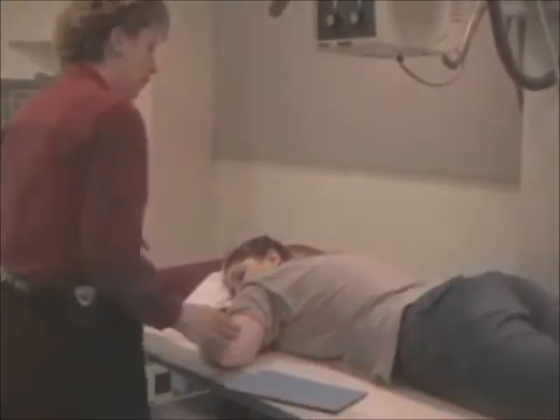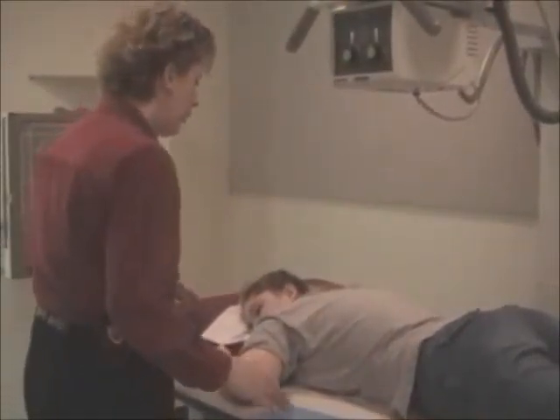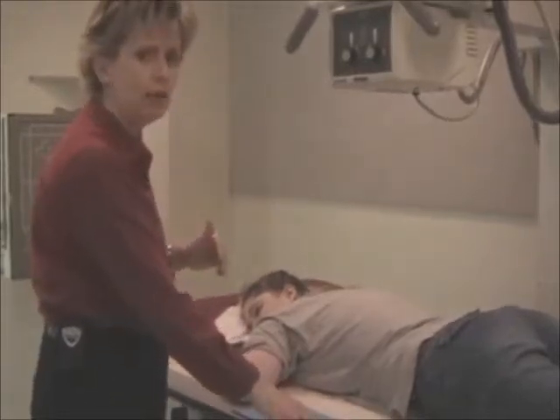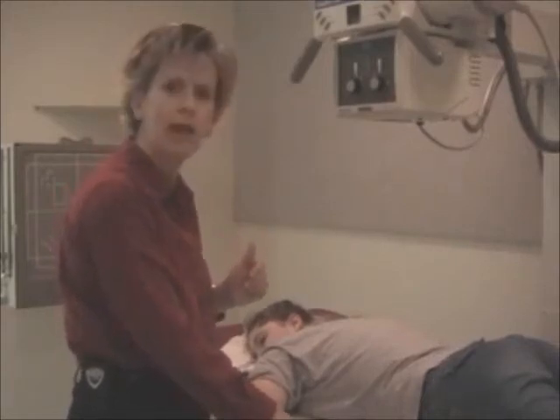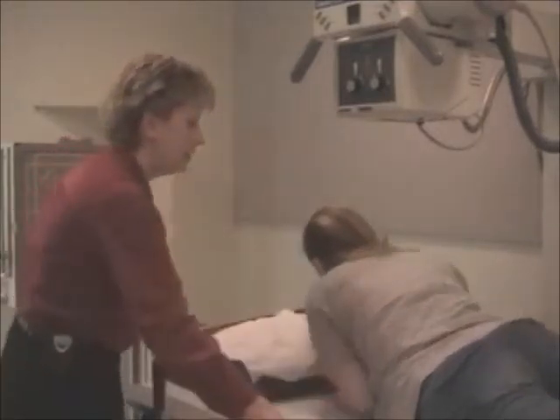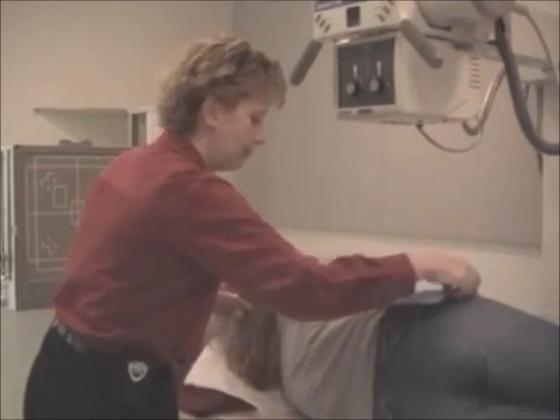Okay, let's go on with another demonstration. We did a right lateral. We've now done the patient PA. It would be hard for you to see a left lateral, but it would be the same as for a right lateral. Okay, let's try to do it anyway. The camera, I can talk you through it. So, Kristen, would you face that wall for a left lateral? Left laterals aren't real common, but you might see it.